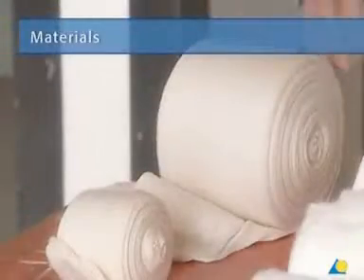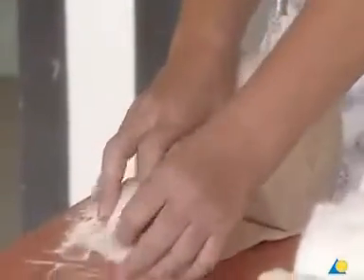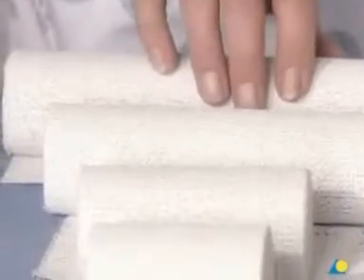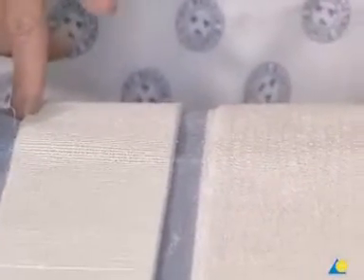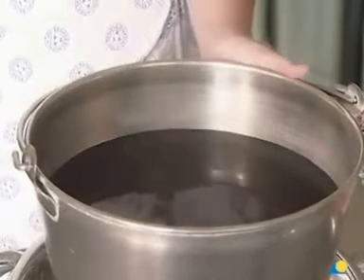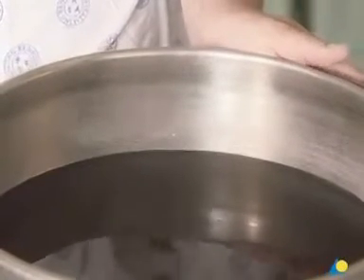To apply the upper leg circular cast, the following materials are needed: a stockinette or tubular gauze bandage, scissors, cotton wool for undercast padding, plaster of Paris bandages which come in rolls of varying widths, plaster slabs generally five layers thick and available in differing widths, and water or another wetting agent. The water should be tepid or lukewarm with an ideal temperature of between 22 and 25 degrees Celsius.